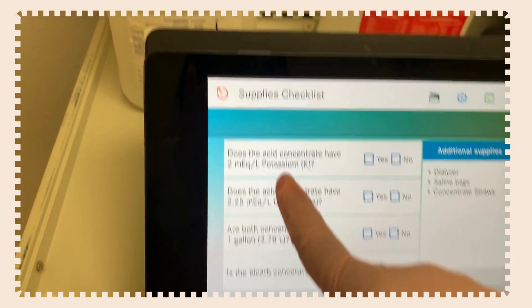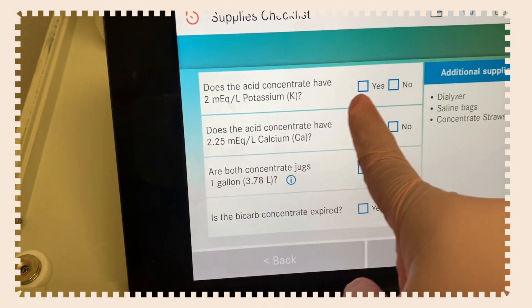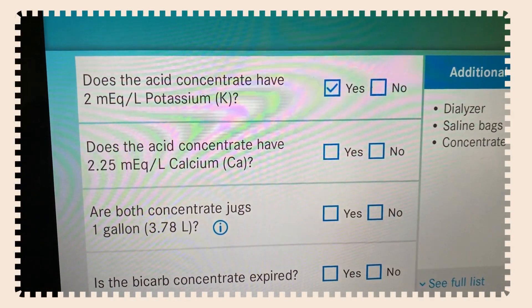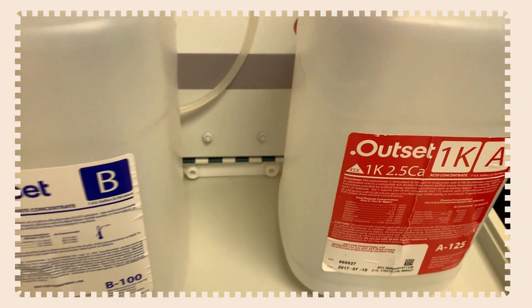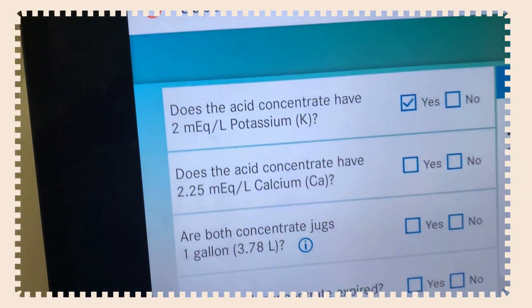The machine asks: does the acid concentration have the correct bath? Hit yes. Then it confirms: does the acid concentration have the correct calcium bath — 2.2? In this demo it shows 2.5, but since this is a demonstration, we want to hit yes and continue.